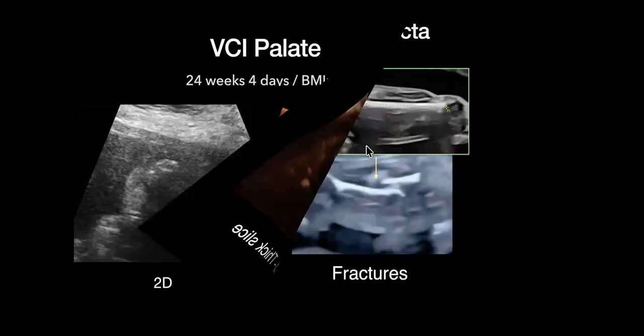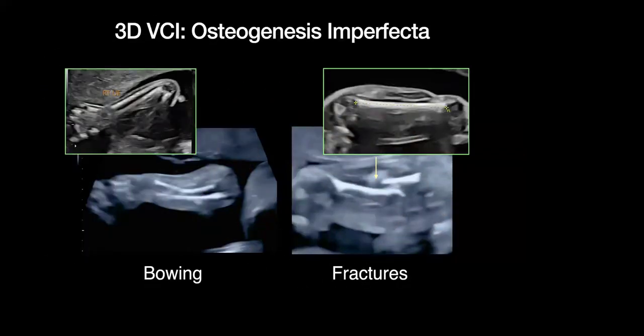So really helpful. Another helpful technique I love to use, especially when you are scanning a fetus and you notice that there is some irregularity, right? Especially in second trimester, looking at the bony structures, especially in cases such as skeletal dysplasia, or there may be fractures, which are present in features of osteogenesis imperfecta. How this can actually enhance the bowing.